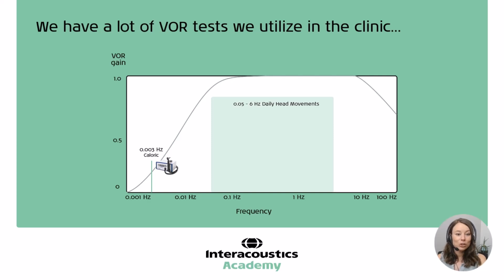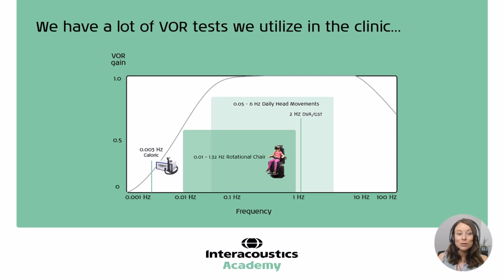We've got the rotational chair assessment, which really looks at a wide spectrum of those mid-frequencies. We have dynamic visual acuity and gaze stabilization tests. Those are a little bit higher, maybe typical daily head movements for most individuals. We've got the vHIT test, a wonderful test that helps us look at those high-frequency head movements. And then this new test, the functional vision head impulse test.